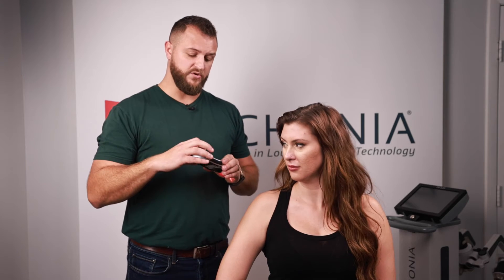If treating a larger area such as the entire abdomen, pull the laser out and wave it back and forth to cover that entire area. For a small area, you do not need to wave it — simply place it and let it rest. Now let's talk about how to optimize results. There are three different ways to use your Urconia laser. Number one is simple: point and shoot — you simply point the laser at the area you're looking to treat. That's good.